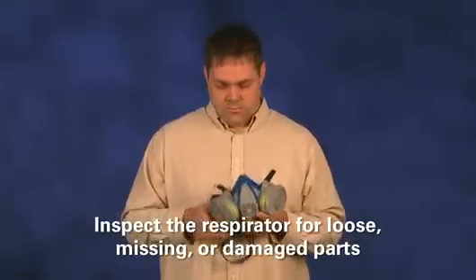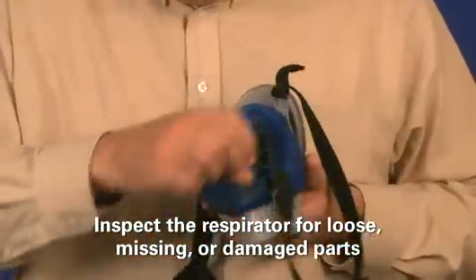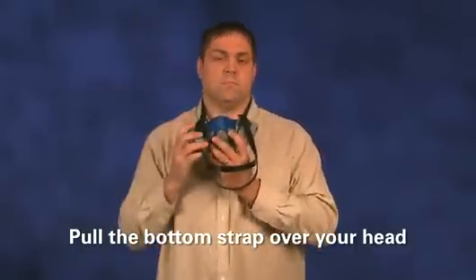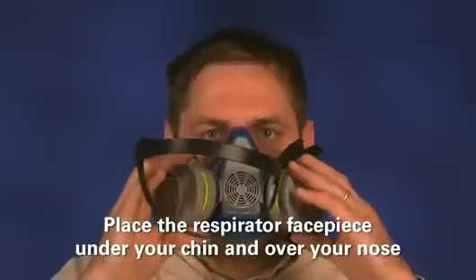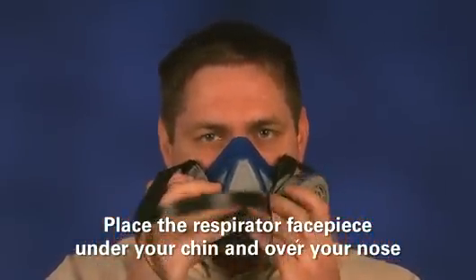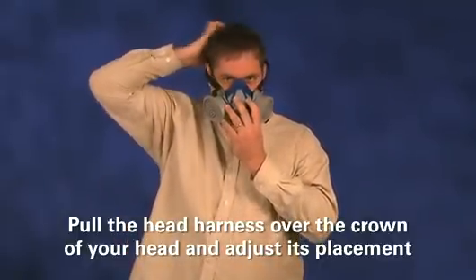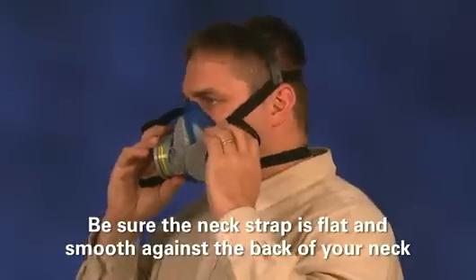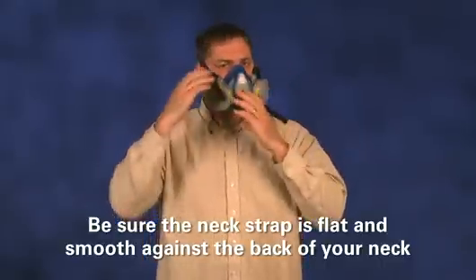To begin, inspect the respirator, including the straps, valves, and gaskets for loose, missing, or damaged parts. If you find any damage to the respirator, repair or replace it. Then pull the bottom strap over your head. Place the respirator face piece under your chin and over your nose, with the narrow part of the face piece over your nose. Pull the head harness over the crown of your head and adjust its placement until it is stable but comfortable. Be sure that the neck strap is flat and smooth against the back of your neck. Adjust the neck strap, but be careful not to over tighten the respirator to your face.